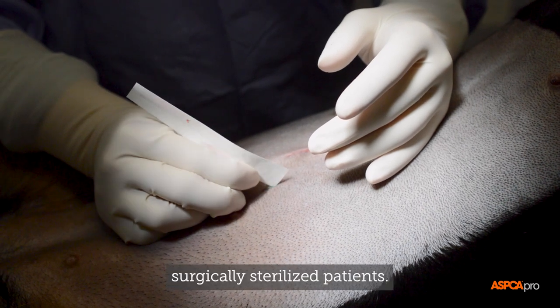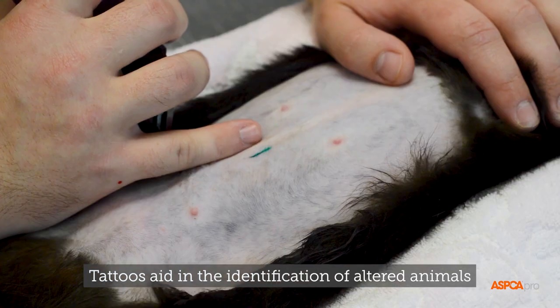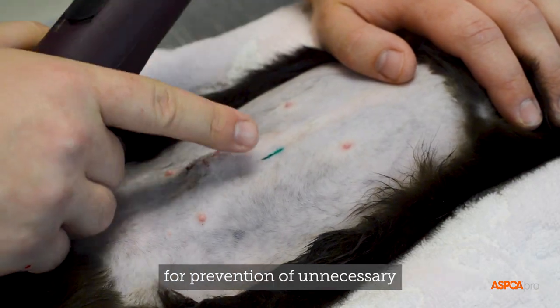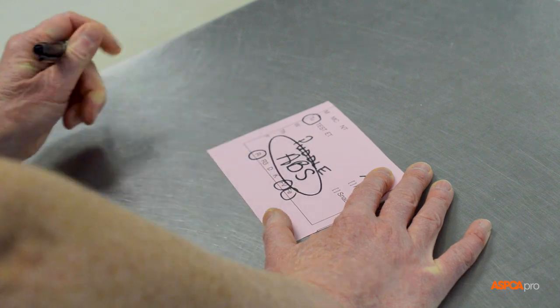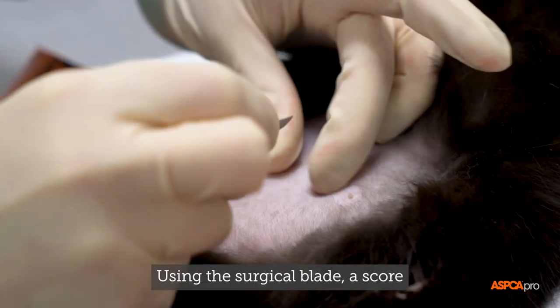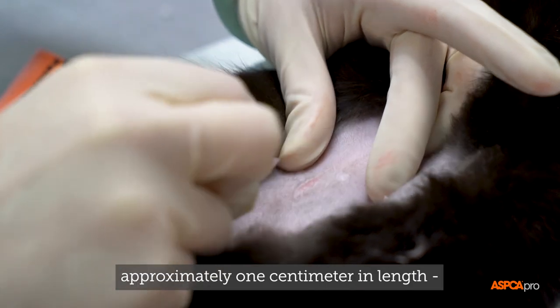Tattoos are applied to all surgically sterilized patients. Tattoos aid in the identification of altered animals for prevention of unnecessary surgical exploration in the future. Using the surgical blade, a score — which is a small shallow incision approximately one centimeter in length — is made into the dermis.